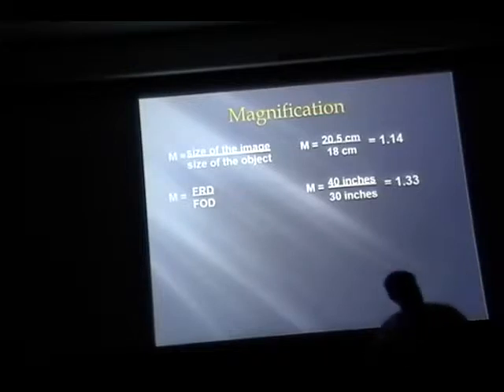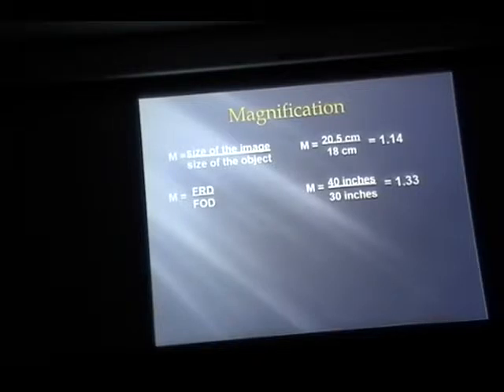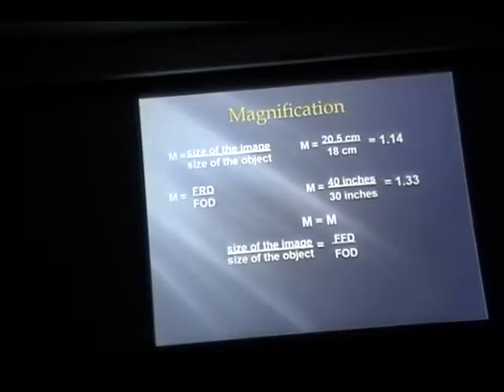I'm not going to ask you this for your exam, but when you try to place an implant, if you want to see if there is elongation or magnification, you use this formula. This is not only for passing your exam here, but it will be helpful for your future as well.